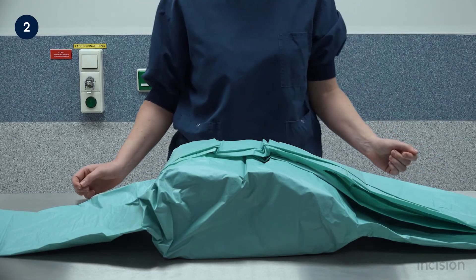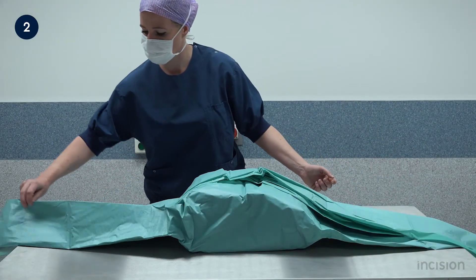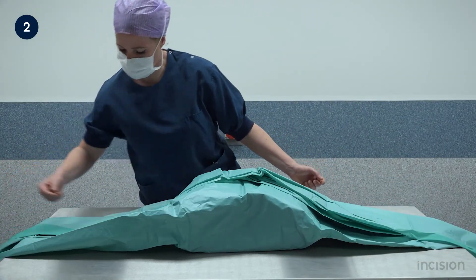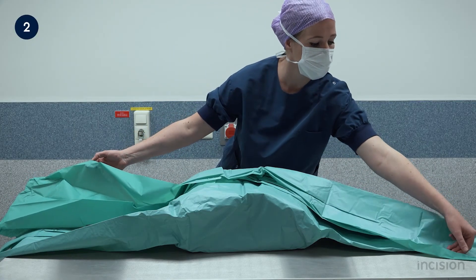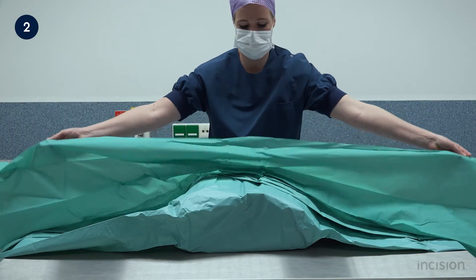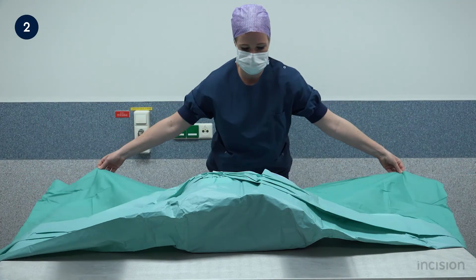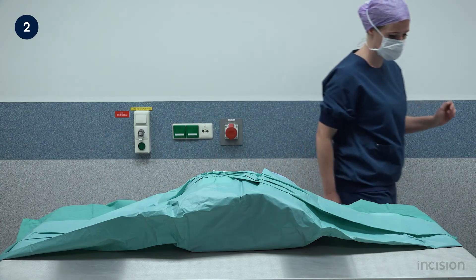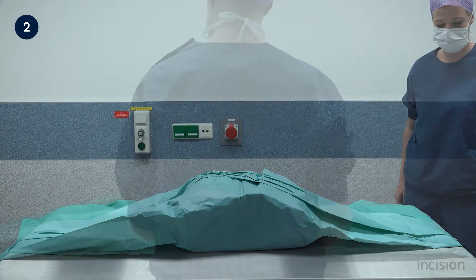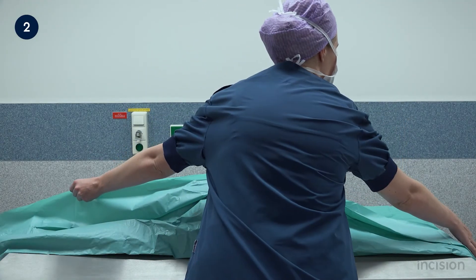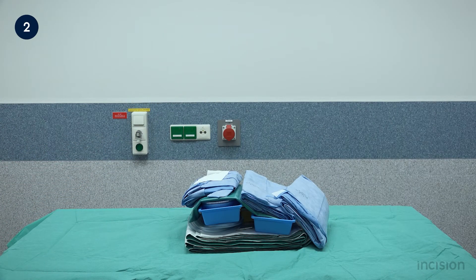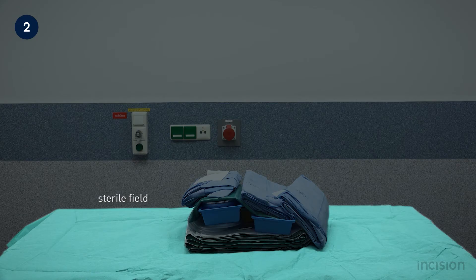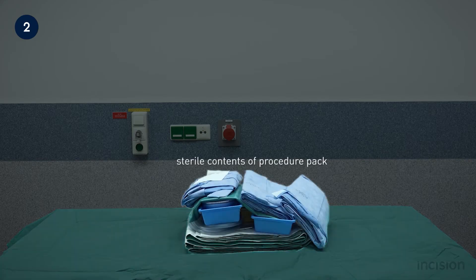This is in order to maintain sterility. Once opened lengthwise, the scrub nurse then opens the procedure pack along its width, again with care taken to handle only the edges of the sterile packaging material. Taking hold of the corners, the packaging material is lifted and lowered along the edge of the table in a controlled manner. To avoid leaning over the sterile field and potentially contaminating it, the scrub nurse walks around to the other side of the table and performs the same action. Take note of the sterile field as well as the sterile contents of the procedure pack.